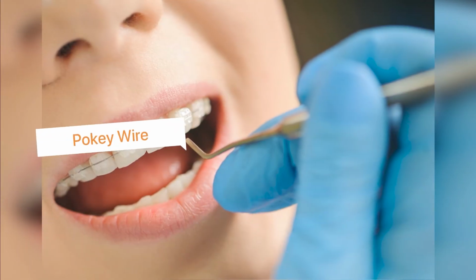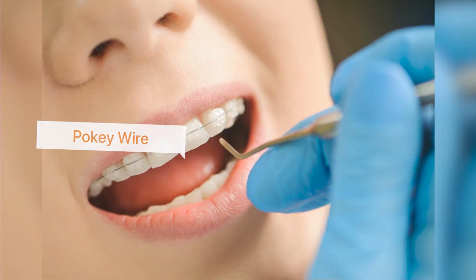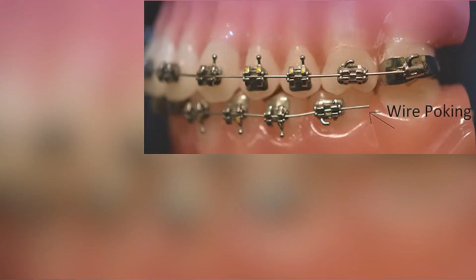Next, we'll talk about pokey wires. We always make sure your wires aren't poking when you leave the office, but sometimes when your teeth move or the wire shifts by accident, it may poke out the back. You should always give us a call first, and while you're waiting, you can put some wax over the area, coating the piece of wire that is long.